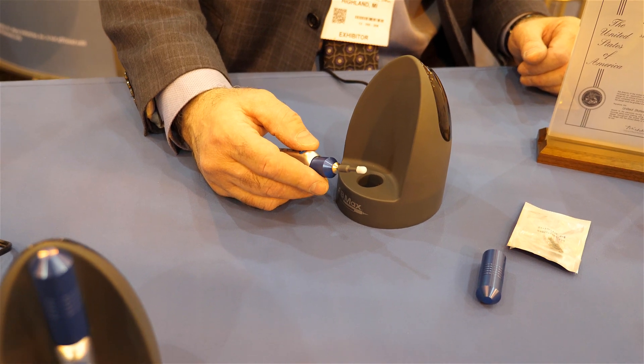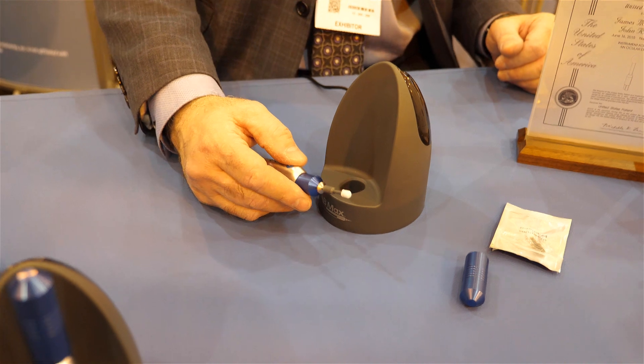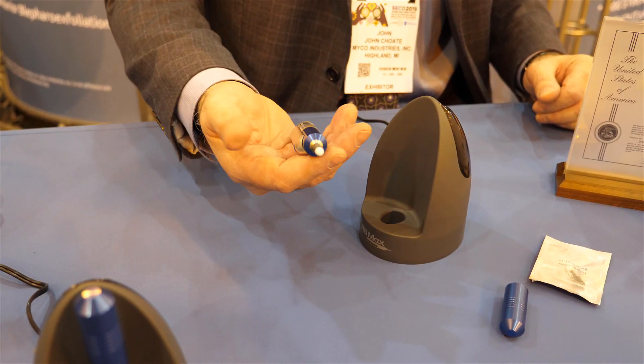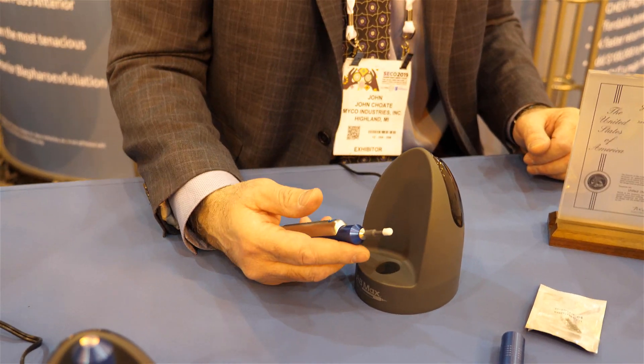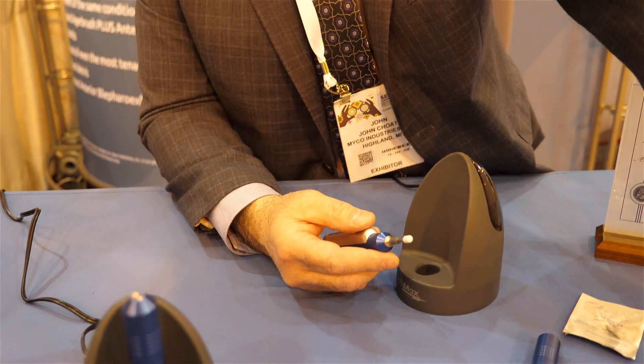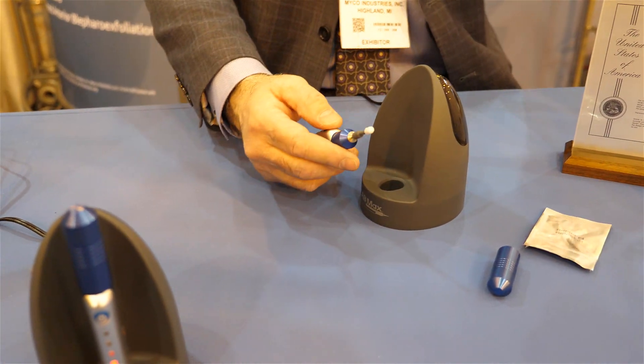If the patient is doing efficient lid scrubs at home — which most of them aren't — they tend to have fewer issues. If they aren't doing them at home, they can see their doctor every four to six months and then be sent home to do their own lid scrubs. As part of our starter pack, we're also including our Eye Check to make sure patients are cleaning it the right way.